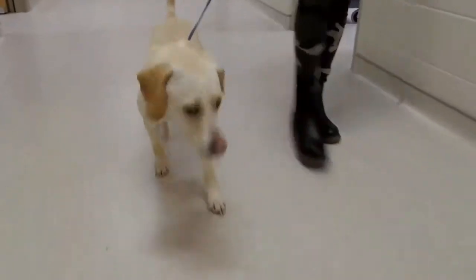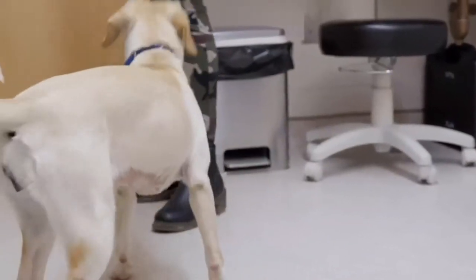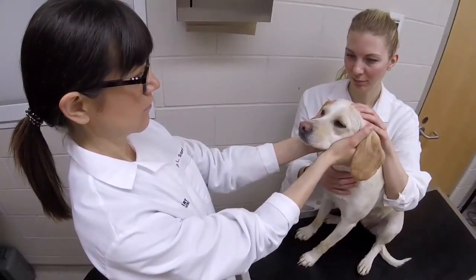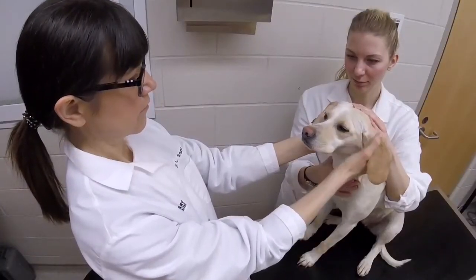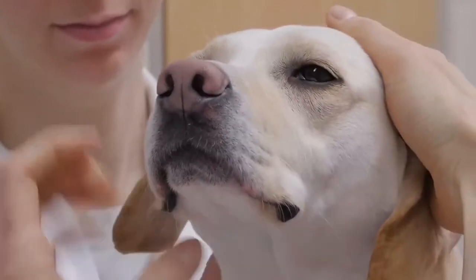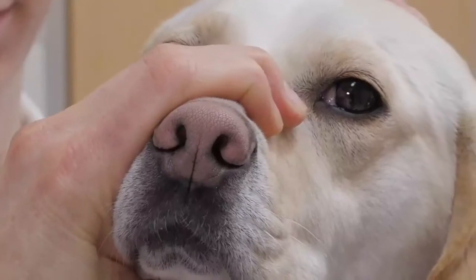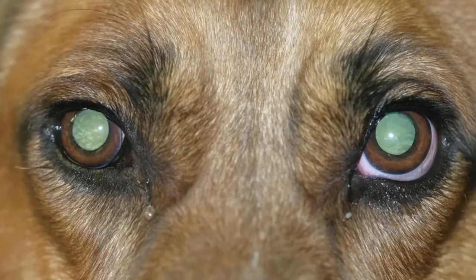The ophthalmic examination begins with observation of the animal at a distance. The animal's attitude, behavior, and ability to navigate in an unfamiliar environment should be closely observed. Observing the animal as it walks into the examination room is the beginning of the distant exam. Next, from a distance, one should evaluate the conformation and symmetry of the face, eyes, and adnexa. Assess the size of the globes, the position or direction of the globes, and the periocular structures and orbits for obvious abnormalities. When directly facing the animal, the eyes should be observed simultaneously from a distance of approximately 3 to 5 feet, eliciting a fundic reflection to illuminate the pupils, i.e. retroillumination. This allows assessment of pupil size, shape, and symmetry, and aids in determining eye position.